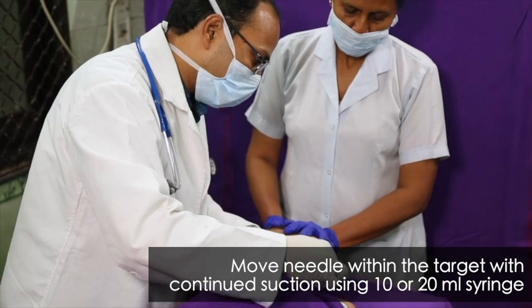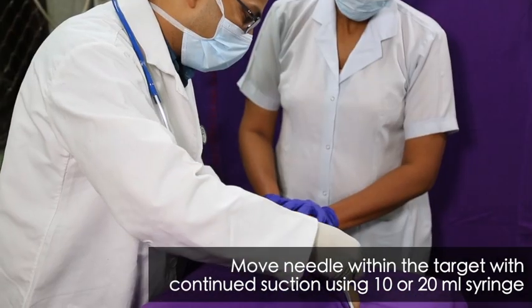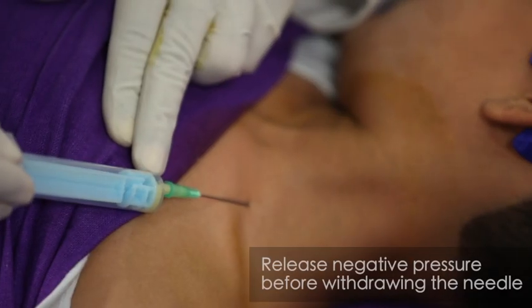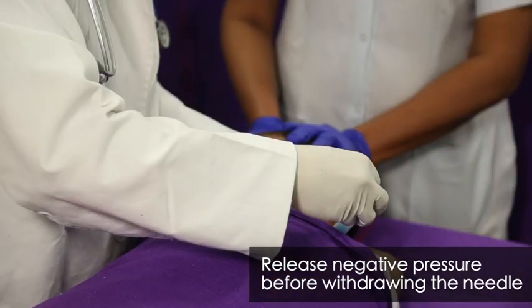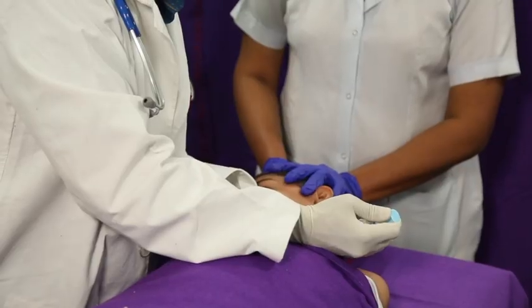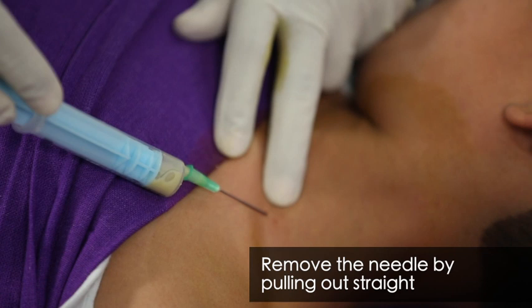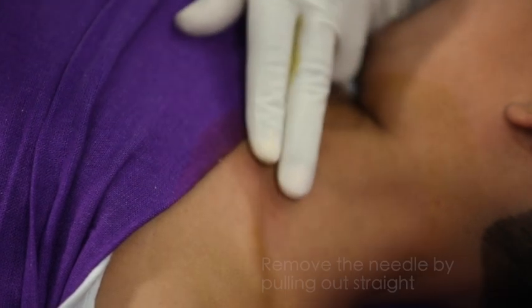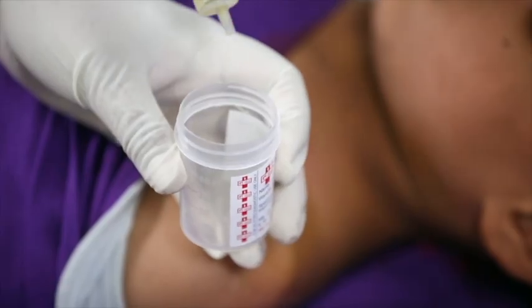Once in the target, the needle tip is moved within the target while applying suction using a 10 or 20 ml syringe. Prior to withdrawal of the needle from the swelling, negative pressure must be released. Remove the needle from the swelling by pulling straight out so as not to lacerate the skin. Remove as much aspirate as possible from the swelling.